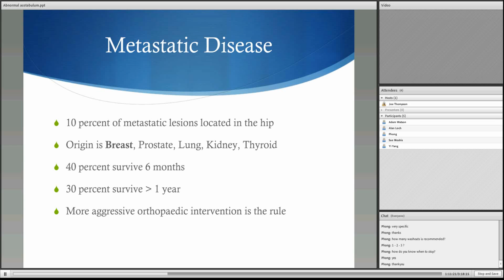The technical considerations on doing hip replacements in patients with protrusio, firstly, is that the jump distance of the femoral head is going to be increased, and quite often can be difficult to dislocate. A way around it is to do an in situ femoral neck osteotomy or to do a trochanteric osteotomy.